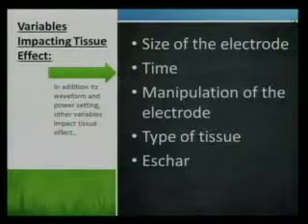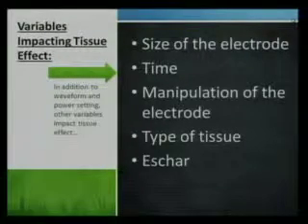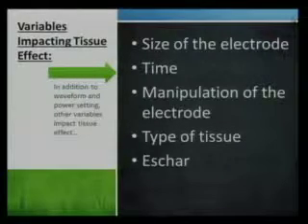If you're really close to the ureter and you're trying to take care of some endometriosis, you don't want to have a bunch of thermal spread because you could potentially cause an injury that might not be detected at the time of your procedure, and the patient could return later with problems. Same thing if you're on the pelvic sidewall and you have all that precious vasculature behind there. You don't want to have a lot of thermal spread. So your dwell time is important to think about.